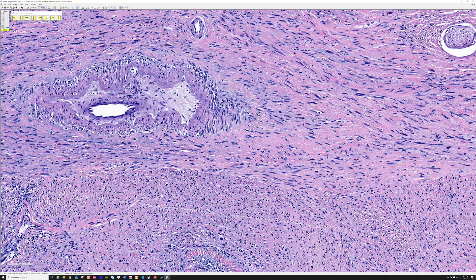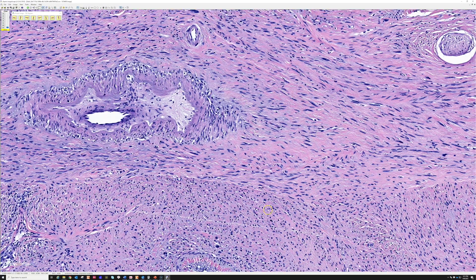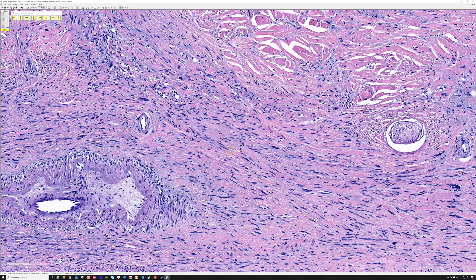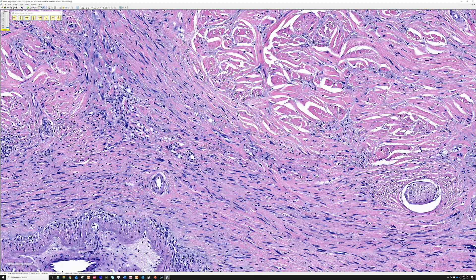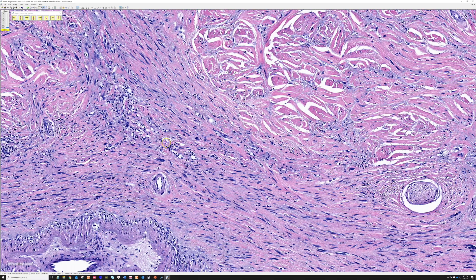The most helpful things to distinguish desmoplastic melanoma from a neural tumor are finding lymphoid aggregates and mitotic figures. On a small biopsy you may not see any mitoses, but if you see scattered pleomorphism plus mitoses in a tumor that looks neural and it's on the head and neck of a sun-damaged older person, that's desmoplastic melanoma until proven otherwise.